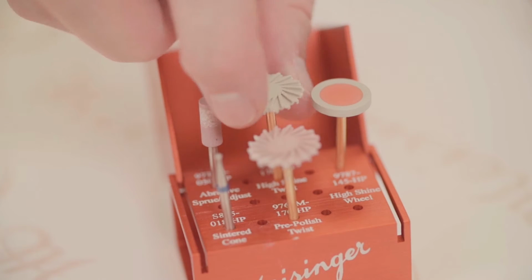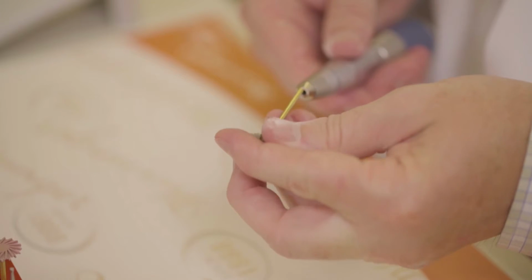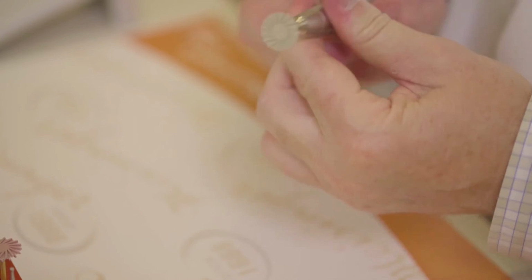With this, we're going to use it on the buccal, the lingual, and the occlusal surface. Again, we're not going to touch the interproximals because we need to protect our proximal contact strength. We don't want to lighten contact.